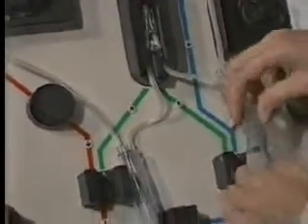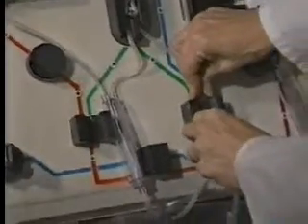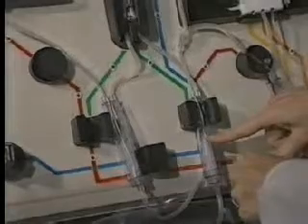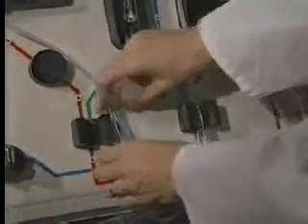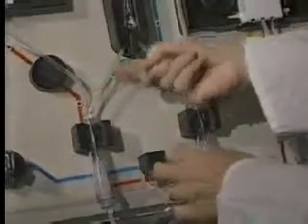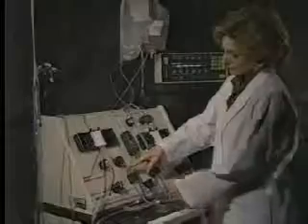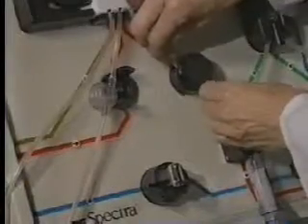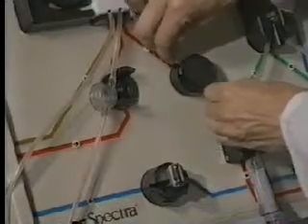Insert the return and inlet air chambers into the air detectors. Be certain to do this with the air chamber filters located below the air detector housings. Ensure that the waste divert lines are toward you. Place the inlet line into the centrifuge pressure sensor housing. Use a flossing action to completely insert the line.